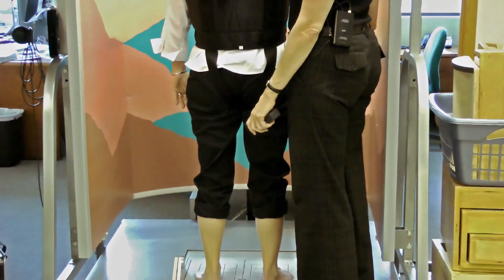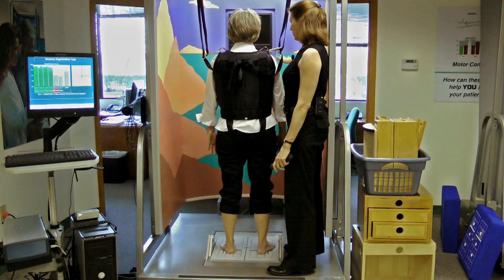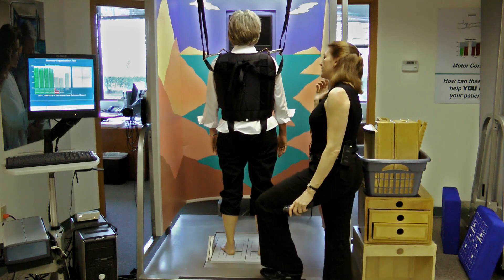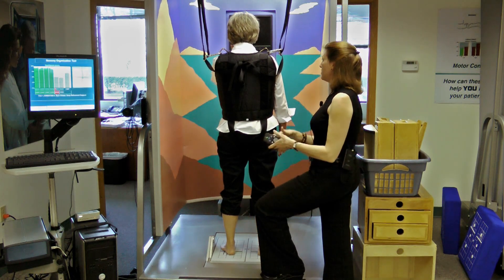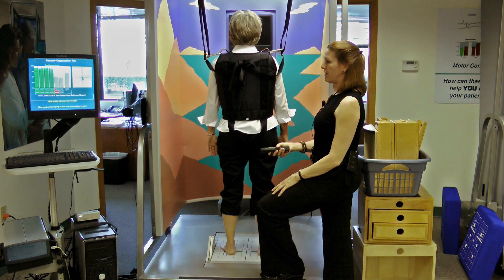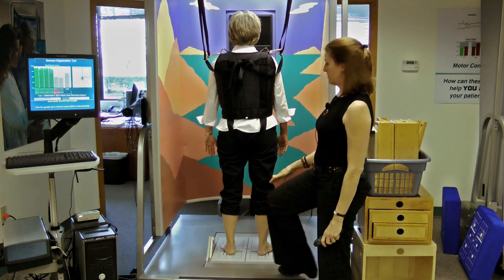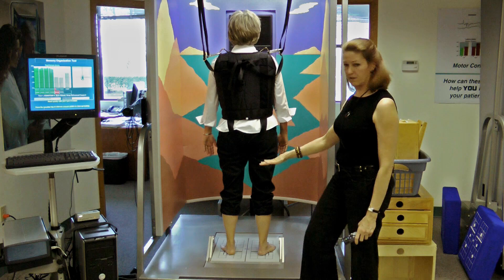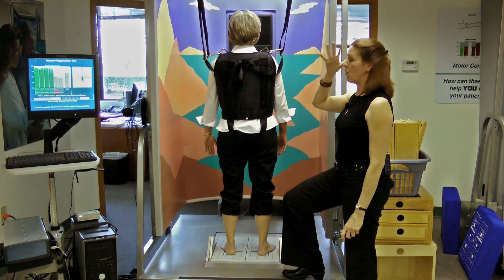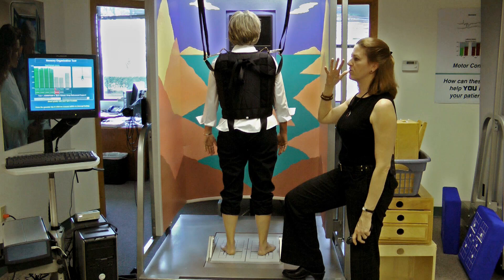You have two more tests on this particular one. The next one, you're going to have your eyes closed and the floor is going to move underneath you. Keep your eyes closed the whole time — if you have to open them for any reason, let me know because I need to stop the test. Close your eyes and testing. We've disadvantaged the somatosensory system by moving the floor, eliminated vision by closing the eyes, and the only reliable sensory system for balance and postural control right now is her vestibular system — she has to rely on that to know what upright is.